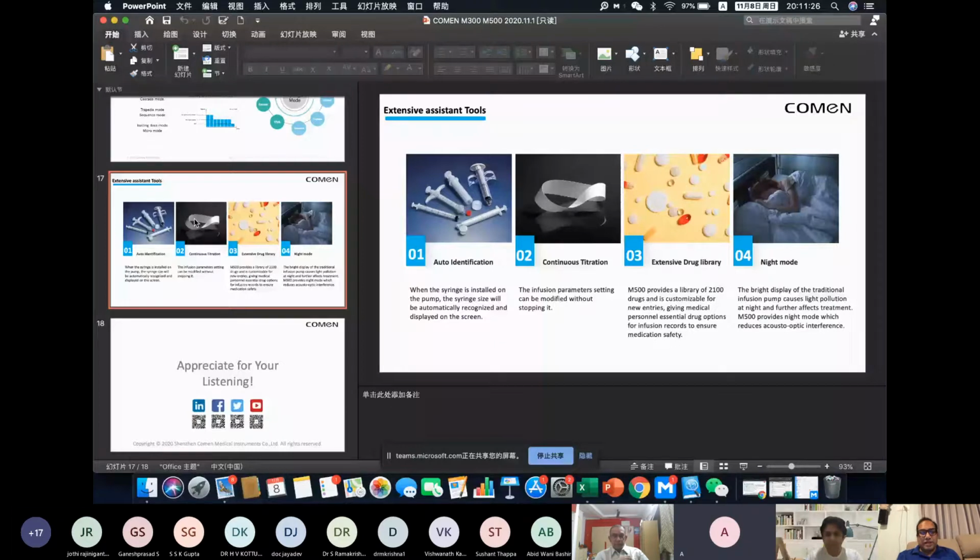No, I understand that. I saw that, but what about drug identification? Because some advanced systems allow you to print out a barcode label identifying the patient and drug, which you can scan using a barcode scanner, and it automatically populates the syringe pump saying what the drug is, what the medication is.